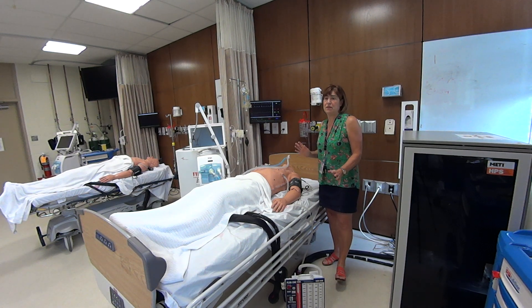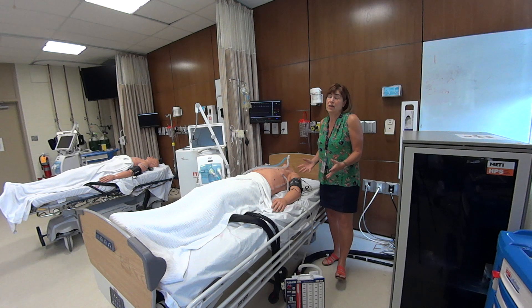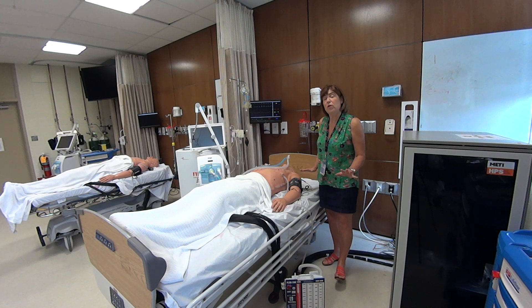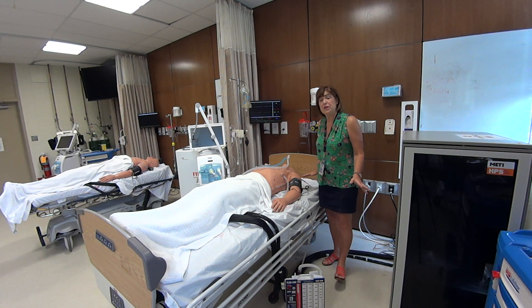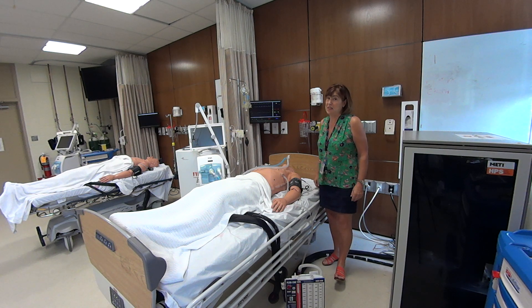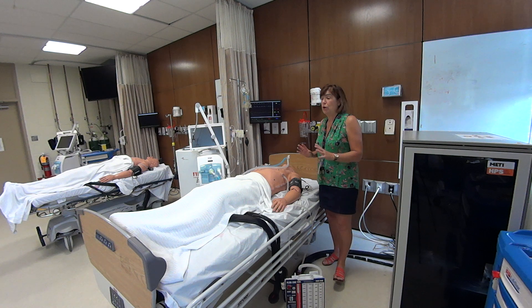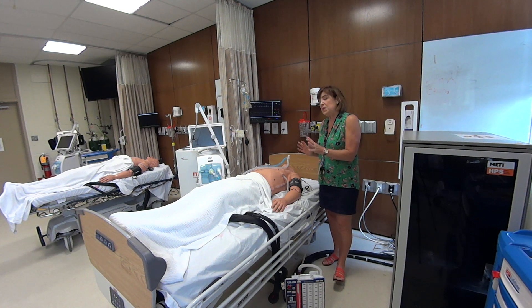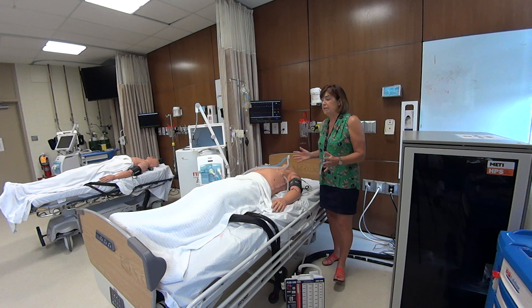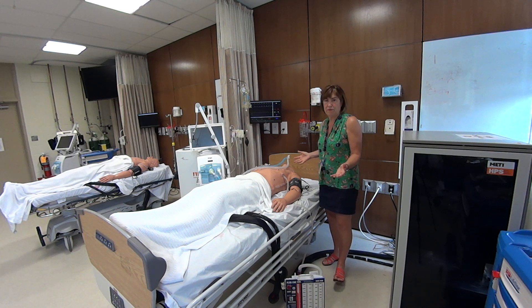We're here at SAIT's simulation center, which simulates the intensive care unit. We want you to know a little bit more about the intensive care unit before you actually see some of these kinds of patients. Today we're going to talk about what kinds of pieces of equipment you might see in here and the kinds of things you might need to be aware of going forward.